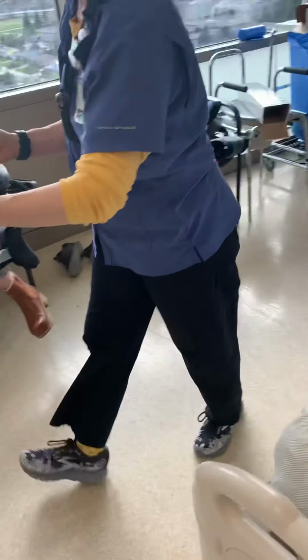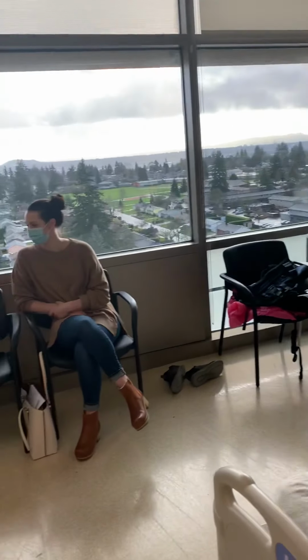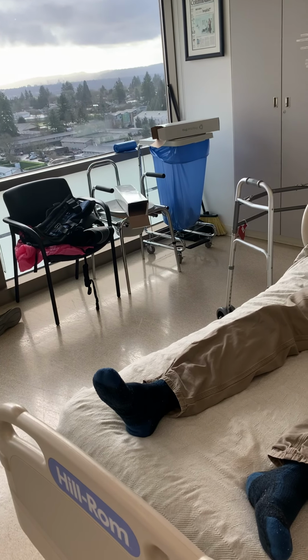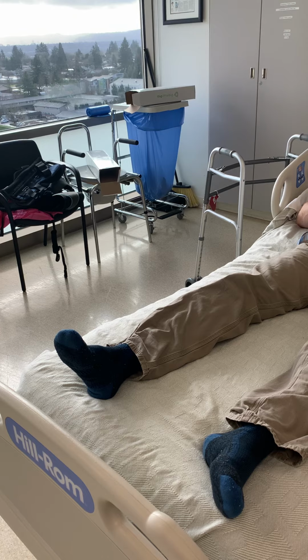You guys probably couldn't see that from over there. So that little lock and unlock there: you do the unlock and pull it out. There, you lock it again.